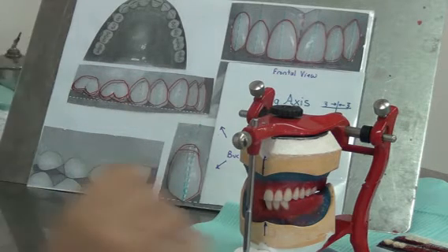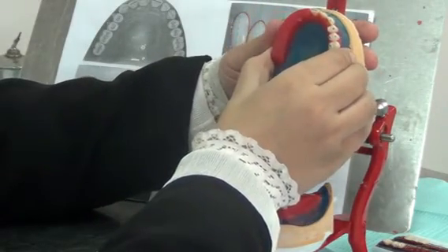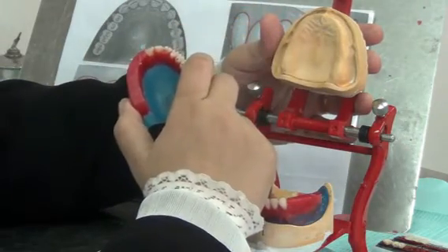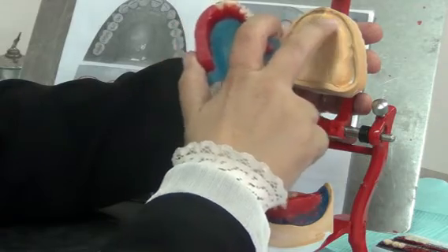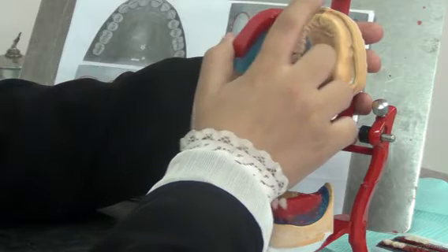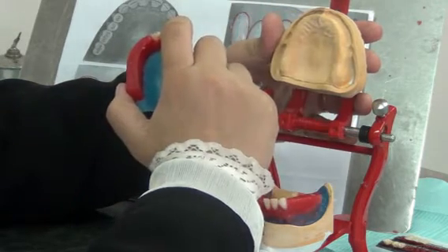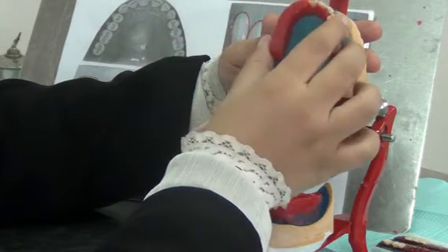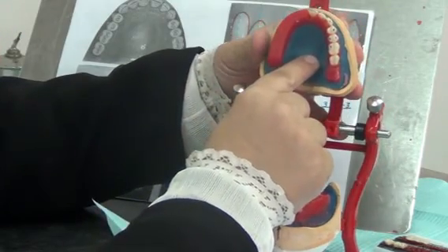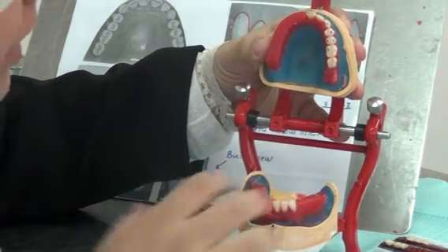Then we check that our setting is inside the incisal arch, the arch lines. When we set teeth, the tooth positions are determined by many reference points. We had the incisive papilla with a canine line explained in the lecture. The incisal edges of the anterior teeth should be 8 to 10 millimeters in front of the incisive papilla. For this we can use an incisive papillometer. But we also can check using a vertical view on the cast that the teeth are not outside the base plate.